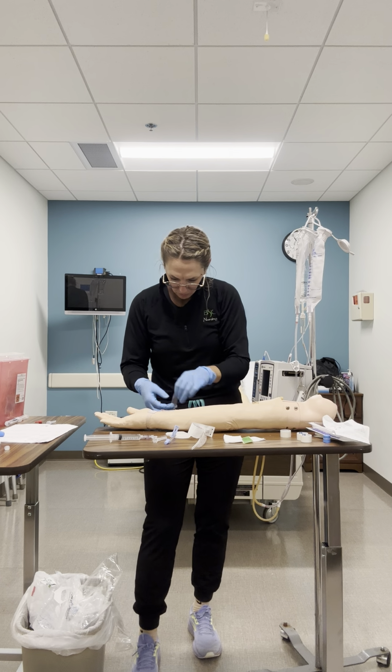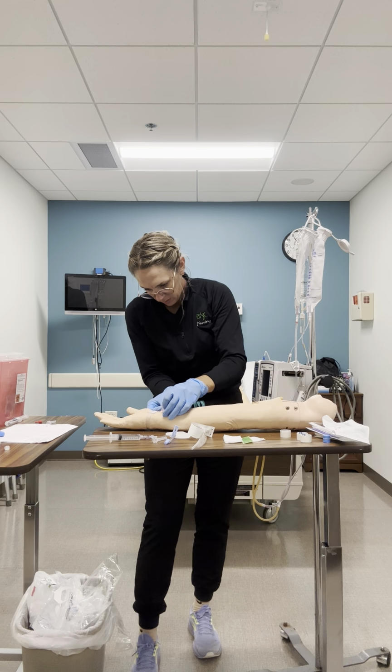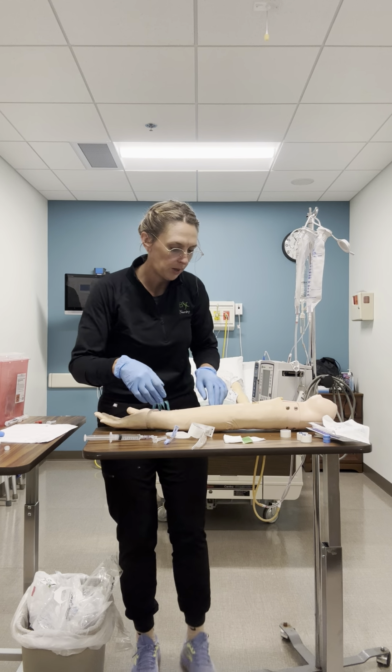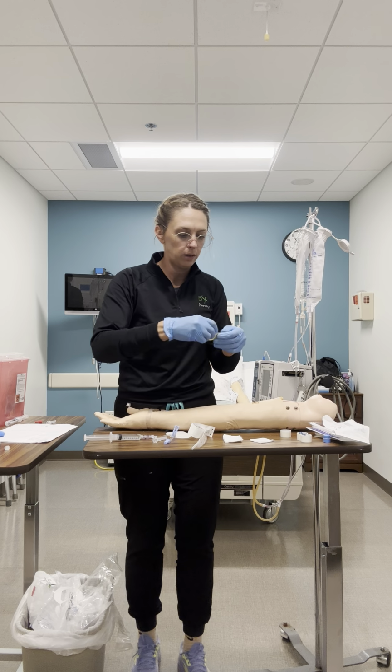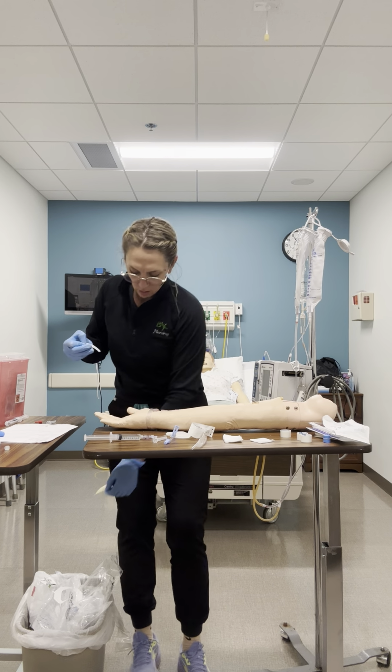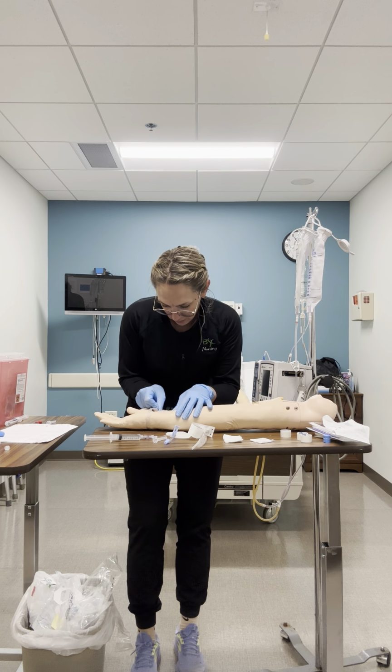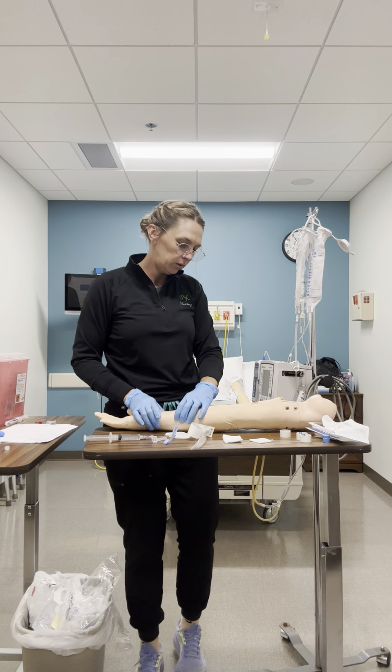I'm going to put one piece of tape over the hub as well. Move this wristband. And we're going to put a label for facility policy on that site.